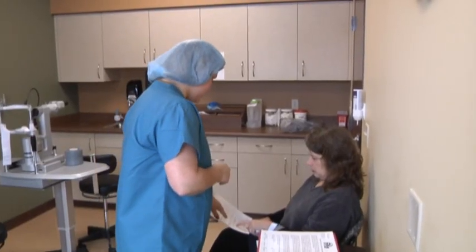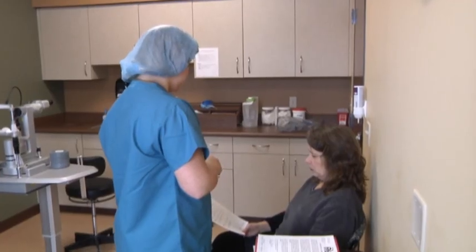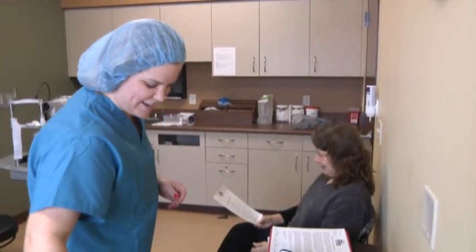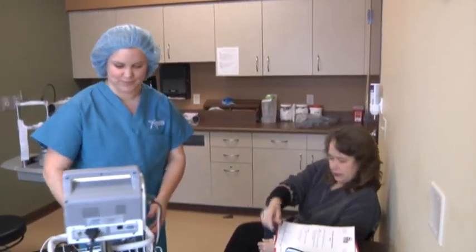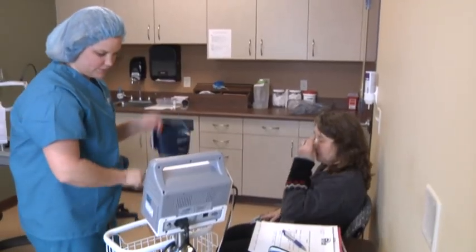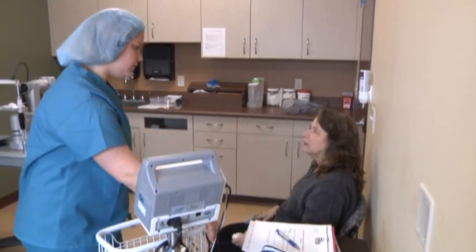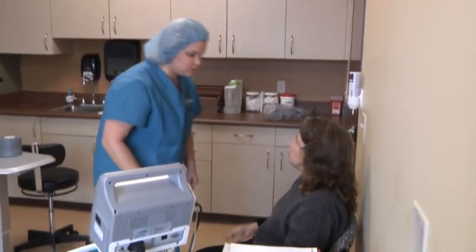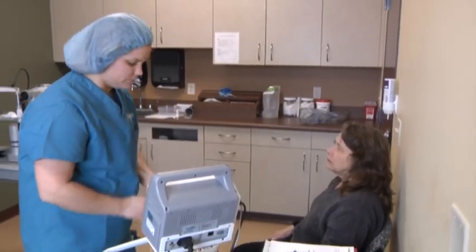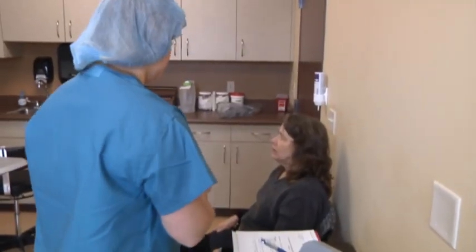They'll see you downstairs in the clinic again on the 14th at 9:40. Do you have any questions about the drops? No, I've done this before. I will just do a quick blood pressure on you. Do you have sunglasses to wear outside? You're going to want those because you'll be dilated maybe even until tomorrow — that's not uncommon. Over the next couple of days you might have some floaters in the vision that will go away on their own. It just takes a little bit of time.